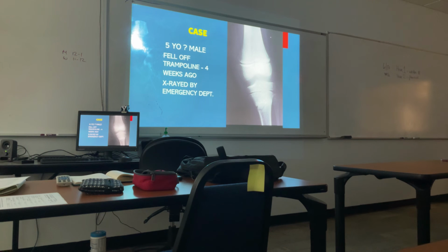Some fun ones, yes. So at your next opportunity, if you're shadowing your doctors, ask them if they use markers after they have the gonadal shields, okay? And if you really want to have a lunch given to you, say, I'm curious, do we take obliques? Yes. If we do a right anterior oblique of the lumbar spine, which pars do we see? They're gonna be like, left. If I don't get left, they owe you lunch.